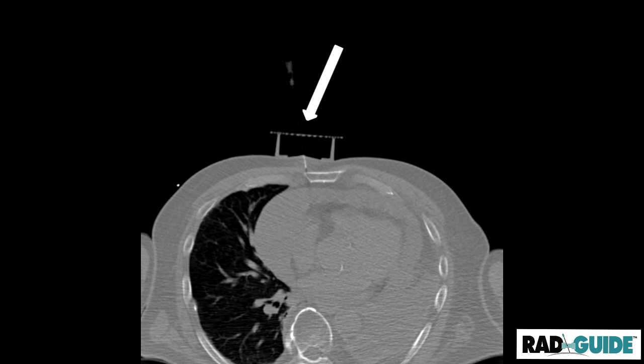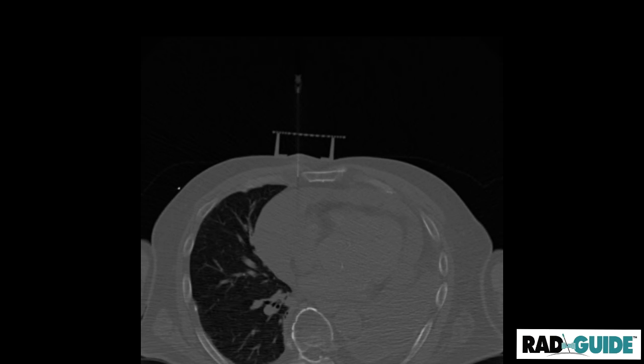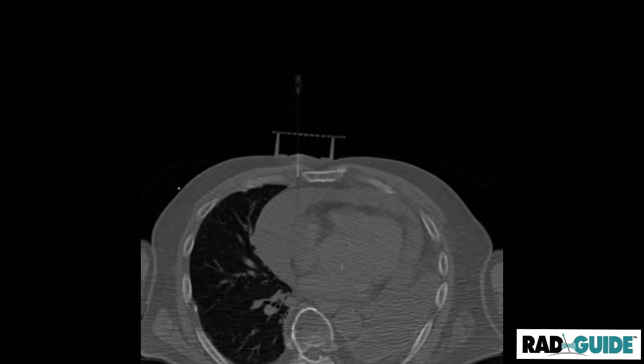from the right, to the third, and I moved the top plate on the left side so I could get the exact safe path to reach the pericardial effusion and mainly avoiding the right internal mammary vessels, which is very important here. Deep local anesthesia was then performed.